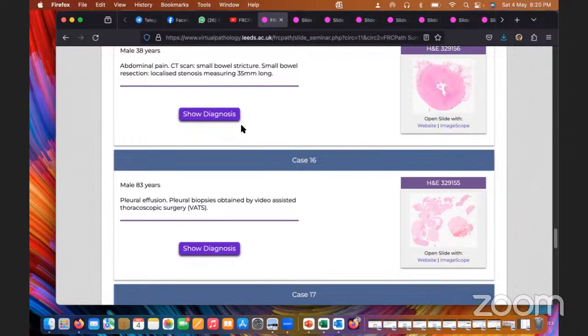Obviously, as we have considered, it can be lymphoma also, it can be sarcomatoid carcinoma also. This kind of differential is accepted, and this is a particular case where you need to be very broad minded, and you put an IHC table with a marker, the lineage specific marker. So yes, melanoma is accepted for this particular case.